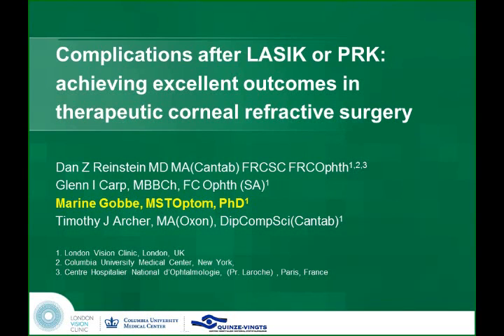And that really is the key inside the Tosca from Carl Zeiss, is that they've managed to calibrate, not perfectly, because there are some areas where it deviates, but they've managed to calculate the influence, for example, of secondary astigmatism on what you will have refracted the patient with primary astigmatism. And so it doesn't correct the primary astigmatism that is accounted for by secondary astigmatism in the topography, for example. And so the refractive accuracy of the Tosca is much, much higher.